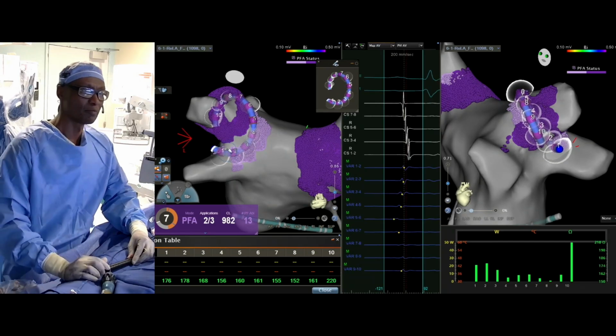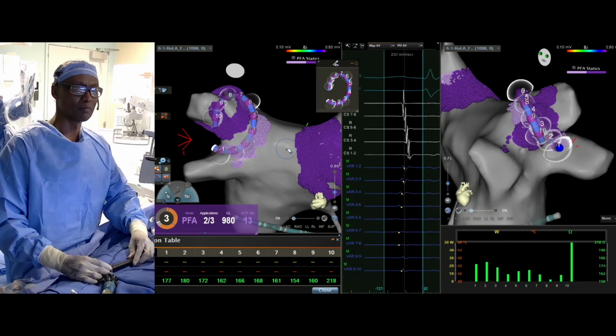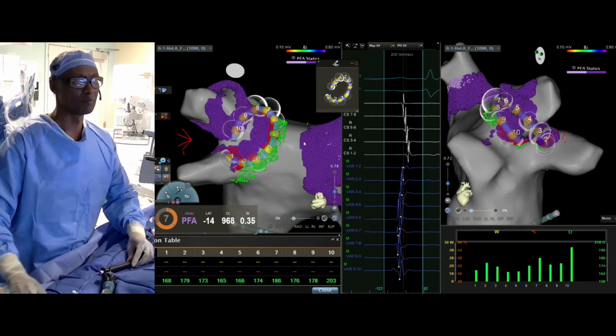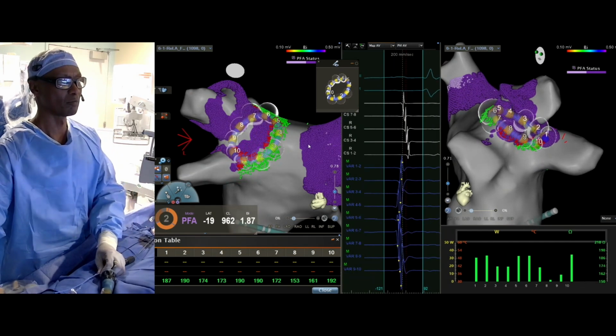Another piece of information that came from the trial was not to exceed 20 to 24 applications. So the recommended applications are basically 4 for one side by 2, 8 is 16 basically.